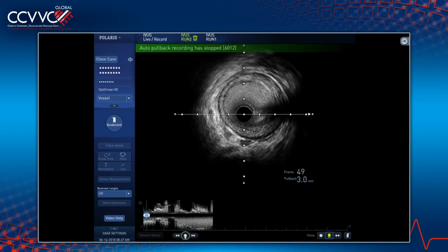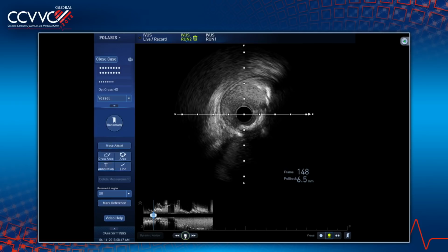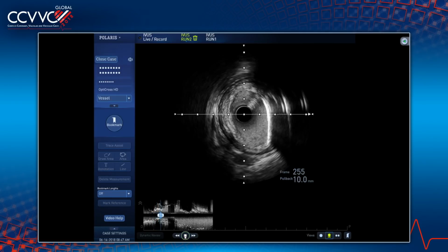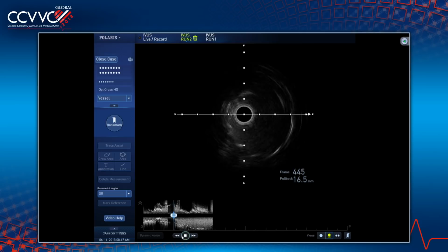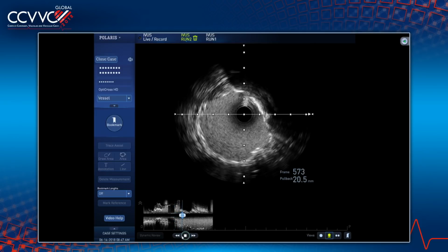Raj, you're happy with this? I think this is a beautiful result. When do we bring the patient back for the TAVR? I think you can wait for a couple of months. The patient actually has had a balloon valvuloplasty. The valvuloplasty should work. She's a lot better off than she started this morning. Everybody happy with that kind of plan here? I would probably bring it back a little sooner.